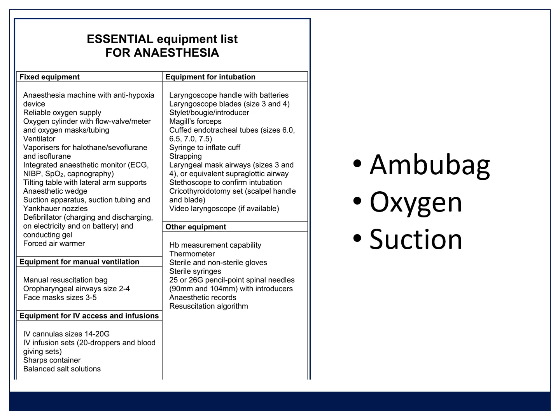And for me, I check that I've got a working ambu bag, check it myself. I do this before every anaesthetic. I check that I've got an oxygen backup source, and I check that I've got a working suction. In particular, working suction is just something you can't substitute for if you don't have it or it fails.